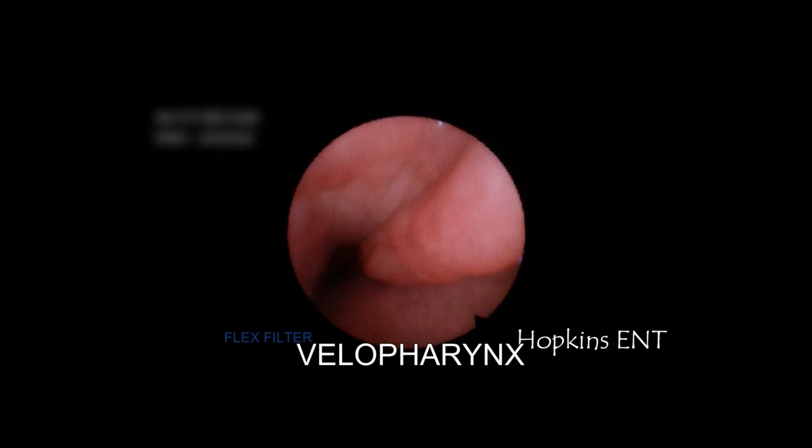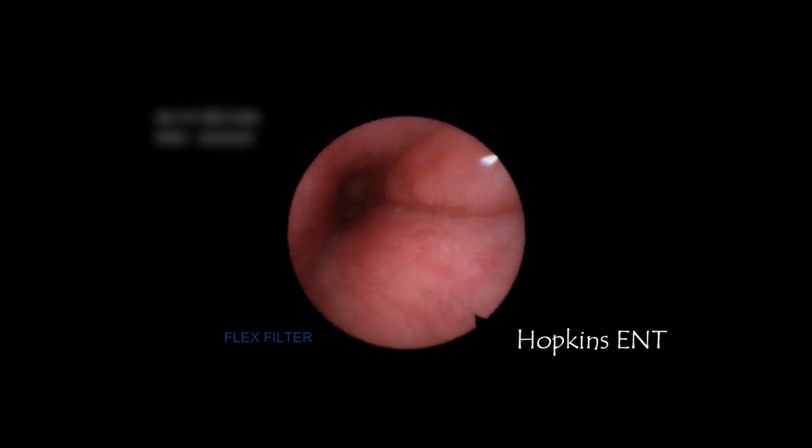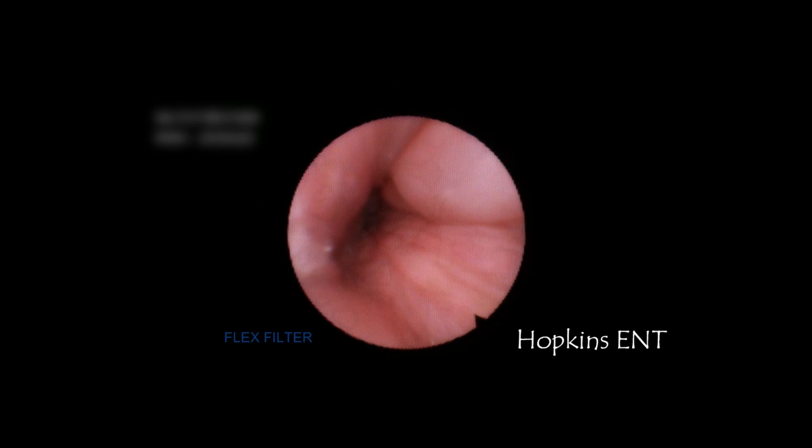The third one is a lateral pharyngeal collapse happening at the level of the velopharynx. As you can see, the patient has a very thick salpingopharyngeal fold which is collapsing in the lateral dimension, causing a lateral collapse at the level of the velopharynx.